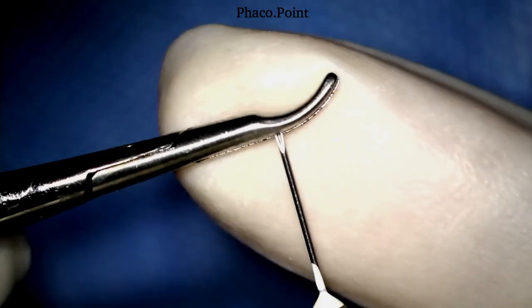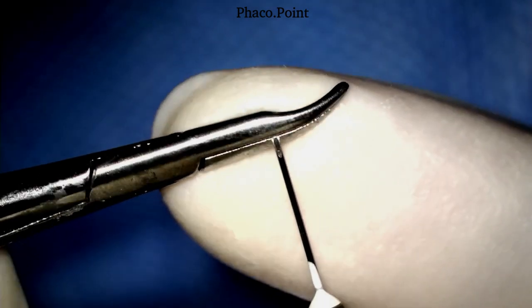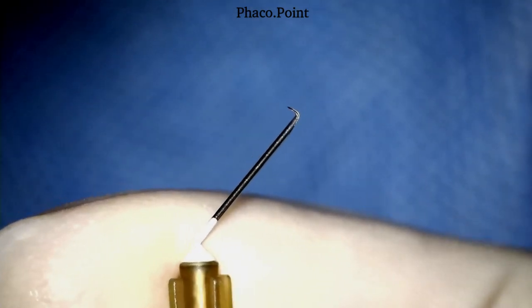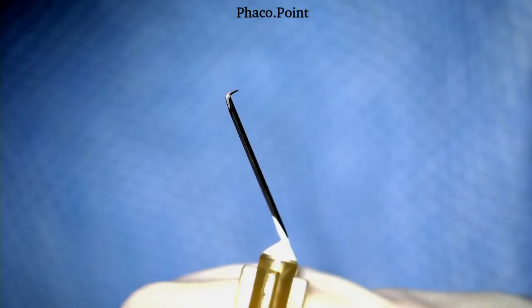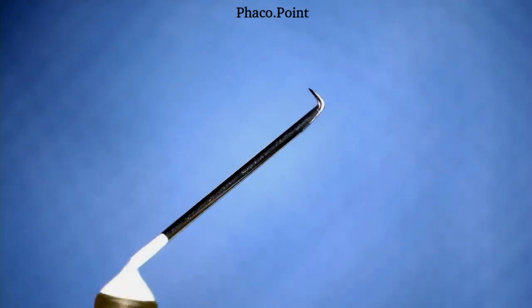In this part of the video you'll see me fashioning a cystitome wherein the bend on the bevel is closer to 50% of the entire bevel. The result is a cystitome wherein the length of the bent part of the bevel at the tip is much longer. I don't personally like such long tips because I tend to bury into the cortex while creating the capsulorexis.